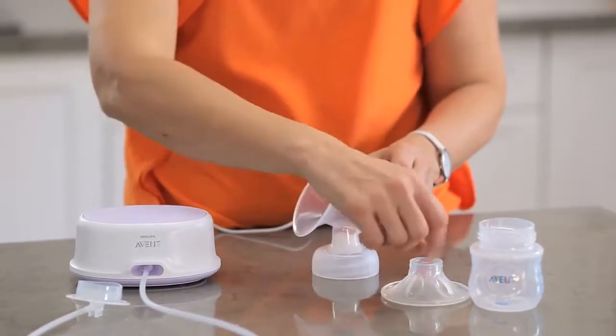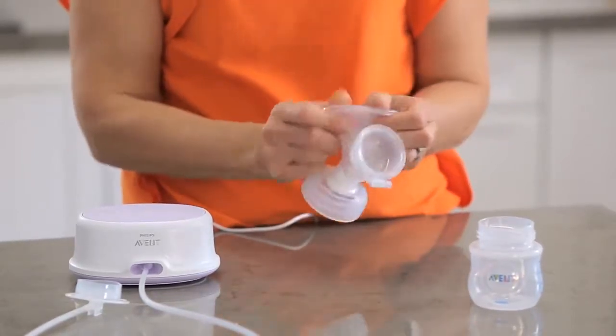Check that the three silicone parts — the valve, the diaphragm, and the massage cushion — are fitting snugly.